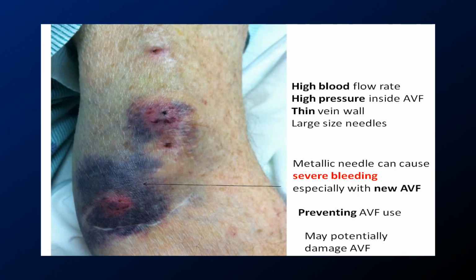Now, if you have a non-traumatic end of the catheter, hopefully that does not occur. Further clinical trials in real patients will be needed to prove what we are trying to demonstrate today. Severe bleeding can cause damage to vessels.